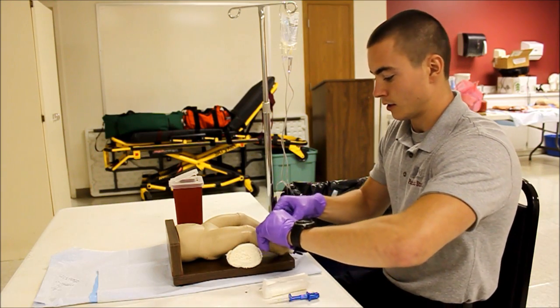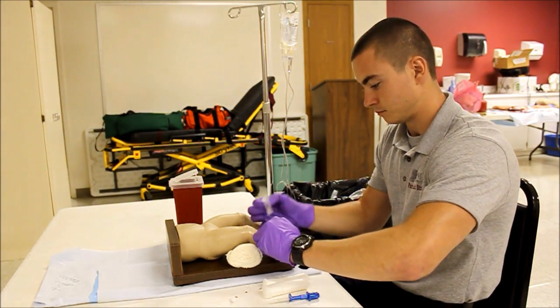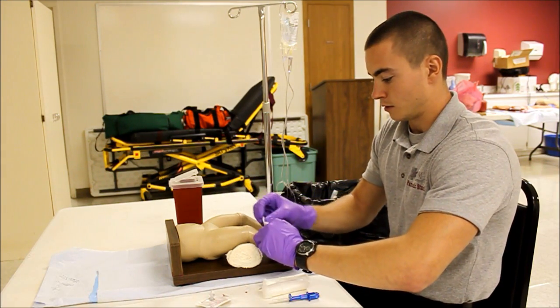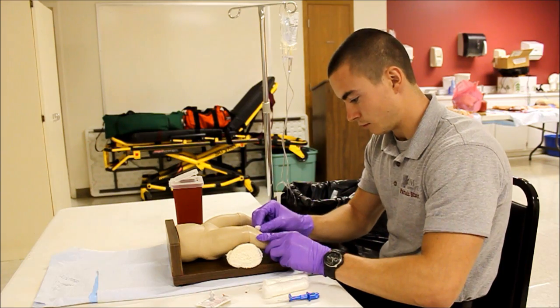I'm going to go ahead and cleanse my site with an alcohol prep pad, cleansing in a circular motion going away from the point of insertion.